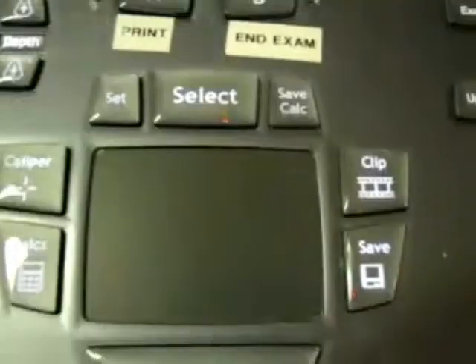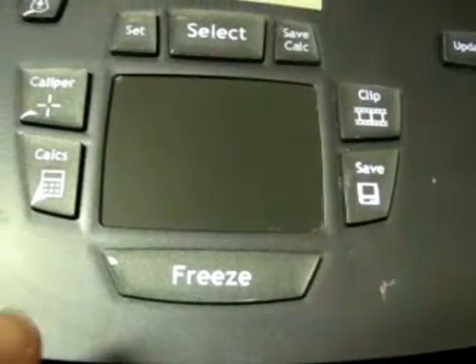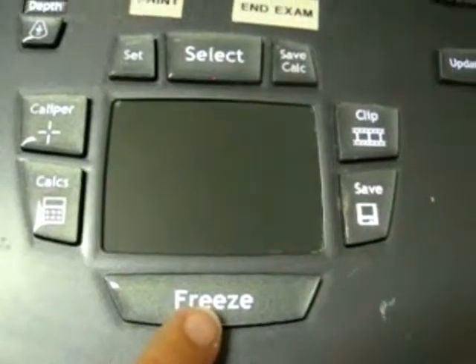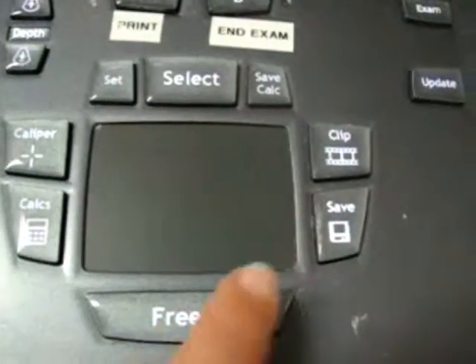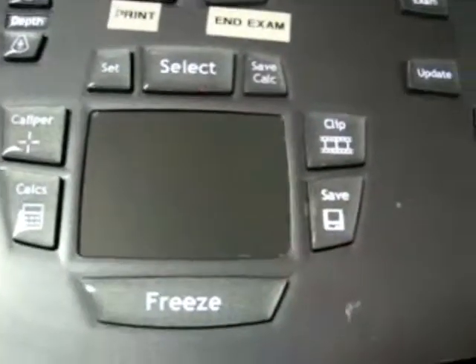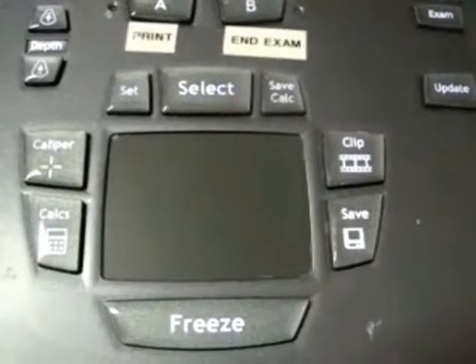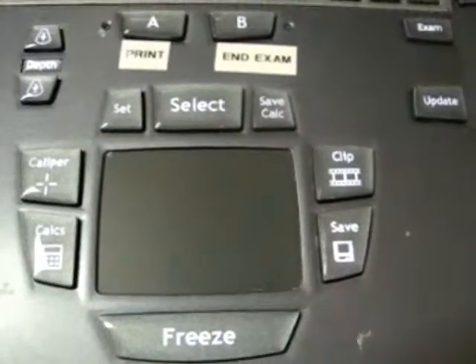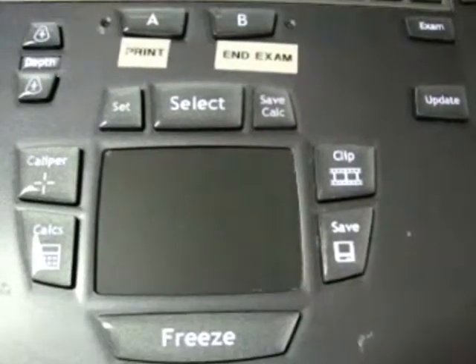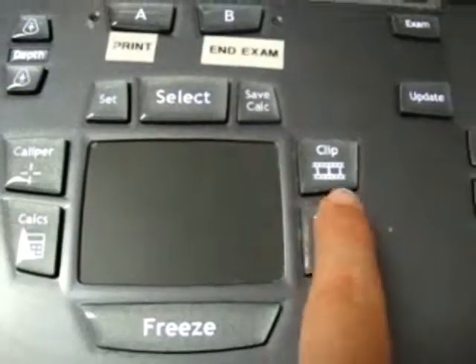When you have obtained the picture you wish to save and it is a still, please touch the freeze button to freeze that frame in place, and then hit the save button to save a still JPEG image. If you wish to obtain a clip, simply press the clip button, which will save most clips for six seconds from the point that you touch it. You do not need to hit save if you hit clip — it will save that clip automatically.